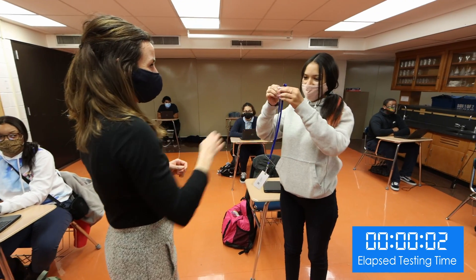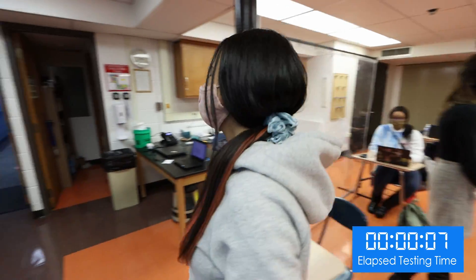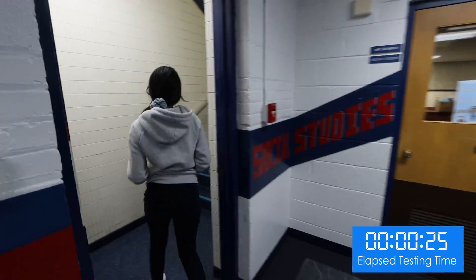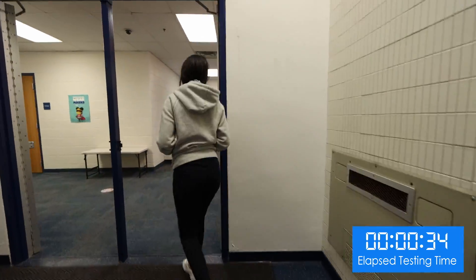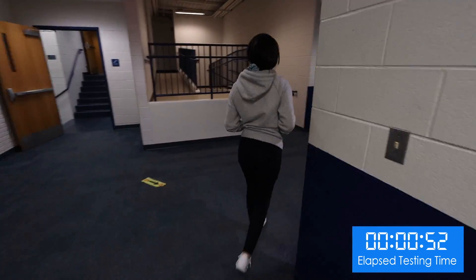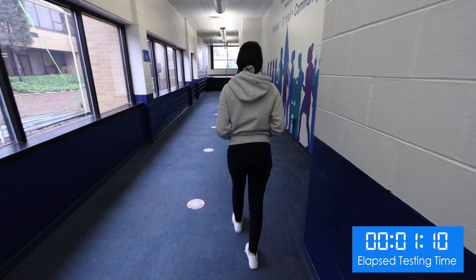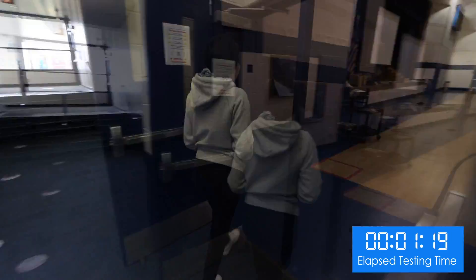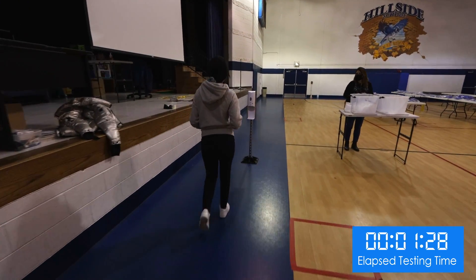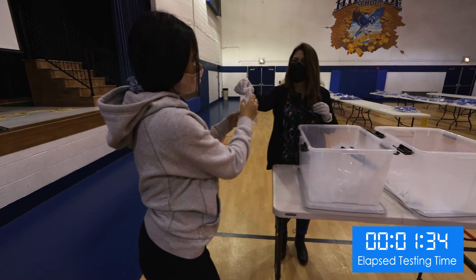The teacher hands the student an ID badge with a personal QR code identifier. Once the student reaches the collection area, she sanitizes her hands and receives her test tube and funnel.